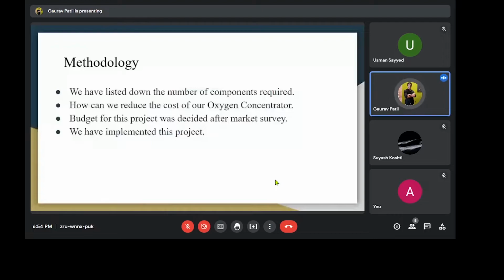Generally, in the market, oxygen concentrators are made using the ATF technique, which is nothing but advanced technology fractionators. This technology is compact and provides a good level of concentrated oxygen as output. But ATF is a patented and registered technology, and it requires huge royalty fees, and hence using this technique is costly.